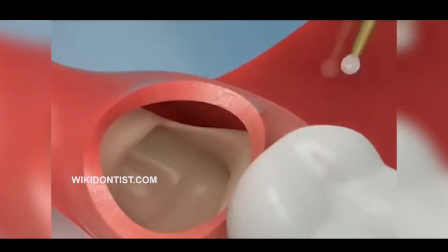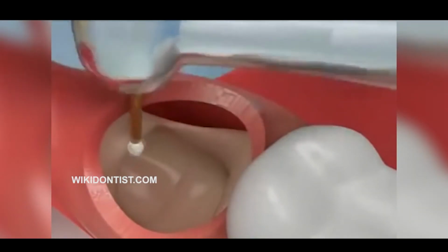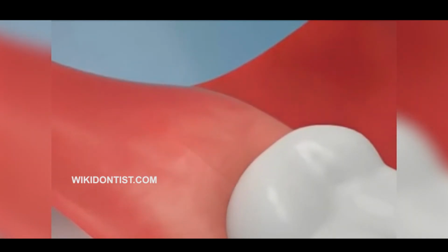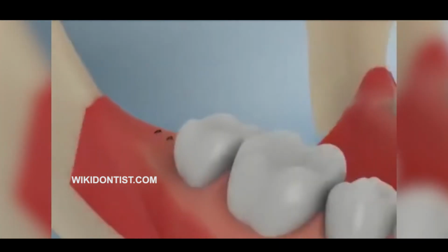So I prefer cutting the tooth into small pieces and taking it out, rather than removing a chunk of bone, so that the post-operative trauma is less. The treatment is also a little faster, and you can do it with much more ease. Once the tooth is removed, we clean the cavity of any debris and place a suture on top. There is no need for a pack or anything. The patient just has to take a course of antibiotics and then we can finish.